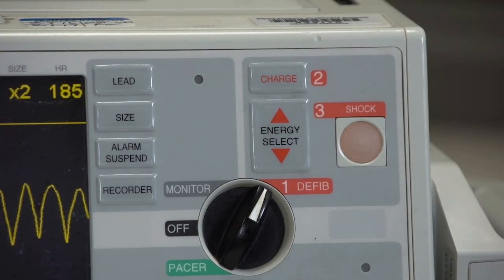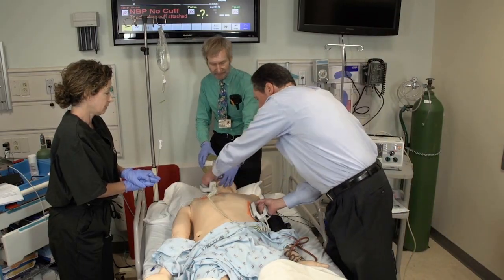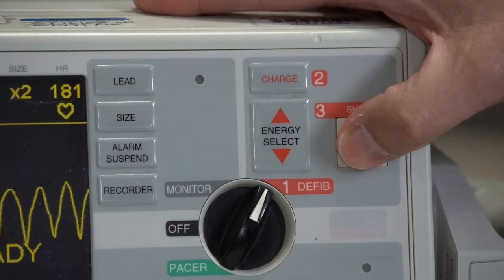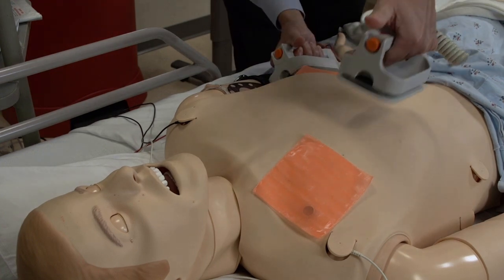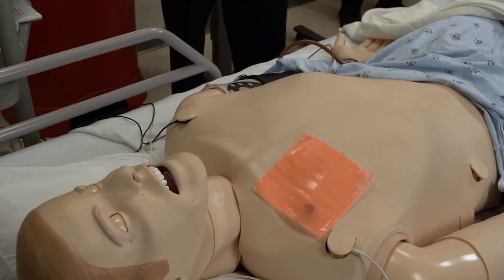When the machine is charged, loudly state, "All clear," and look to ensure that no personnel are touching the patient or the patient's bed. If using pads, deliver the shock by pressing the button on the machine. If using paddles, press down firmly on the chest wall and push buttons on both paddles at the same time.